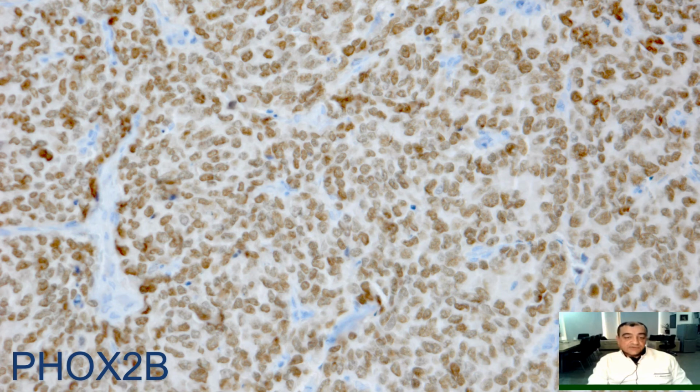As in this case, you can see very nice nuclear staining in neuroblastoma, but ganglioneuromas, ganglioneuroblastomas, and pheochromocytomas can also show positive nuclear staining with this antibody. It is highly specific and highly sensitive for cells of neuroblastic origin.